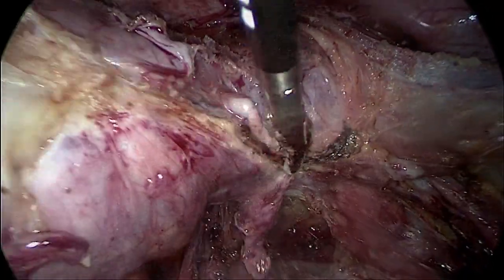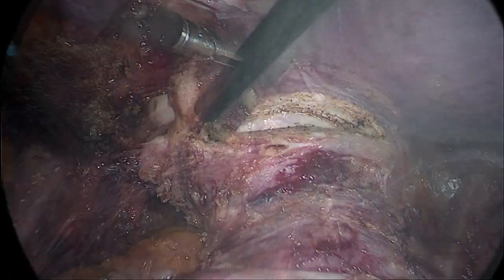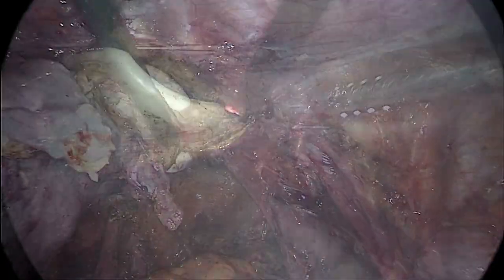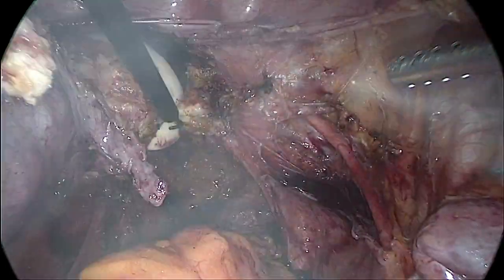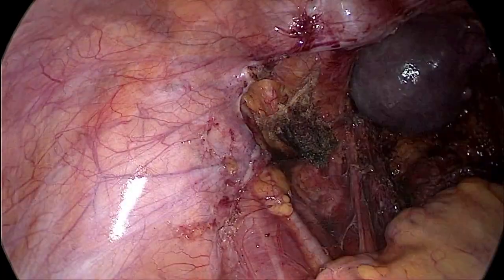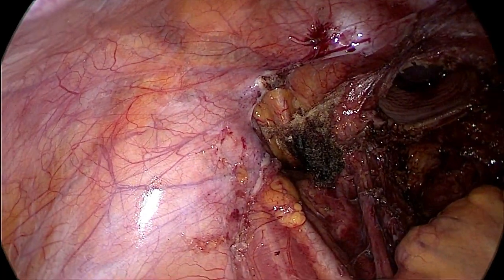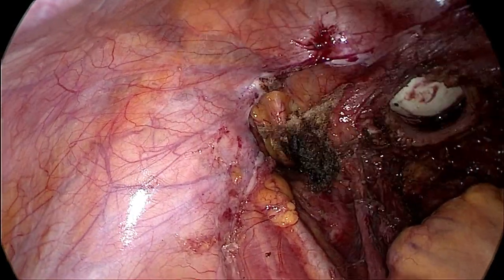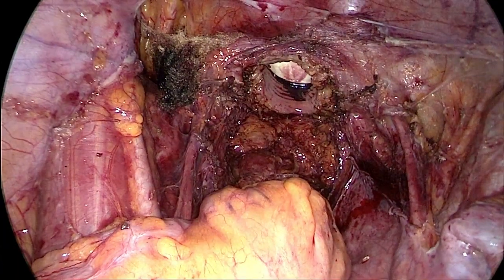The uterine manipulator facilitates vaginal wall incision. Finalization of hysterectomy with transvaginal removal of the specimen is performed. The vaginal plug is then inserted for maintenance of the pneumoperitoneum during the surgery.